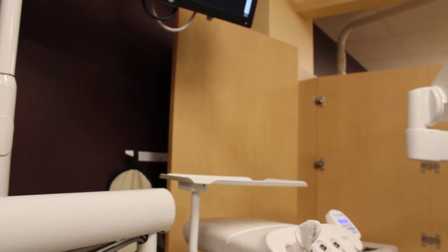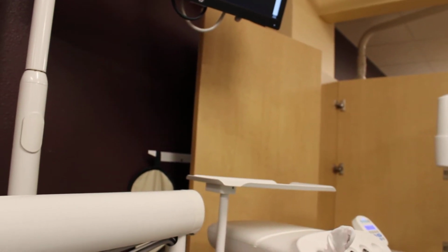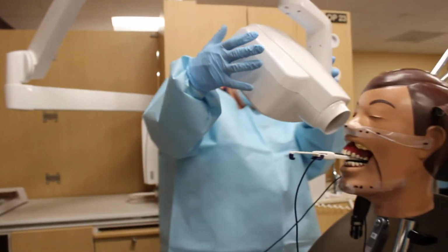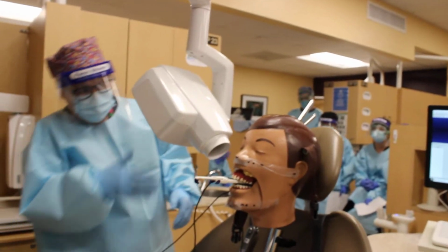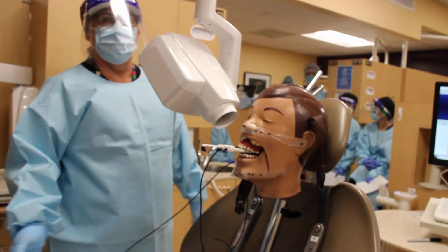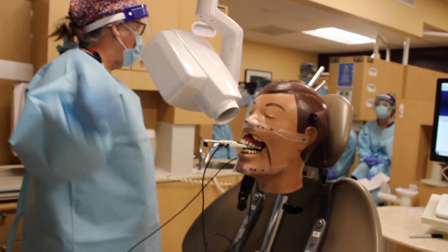Cool. My horizontal's a little off, but I got the apex. Got the root tips. My horizontal's a little off. I needed to go this way. And if I had looked in there and looked the way his jaws are, I would have seen that the horizontal was off. I got overlapping.